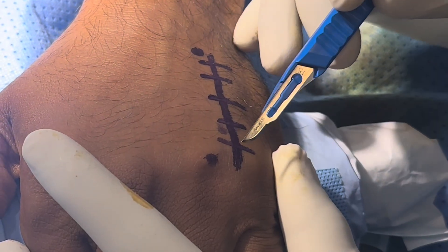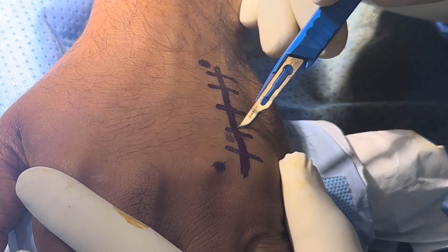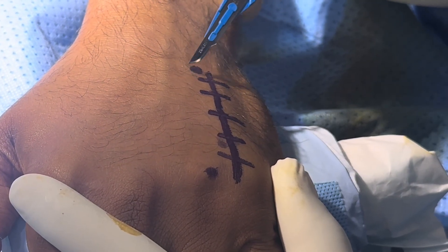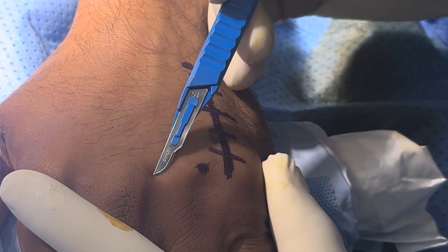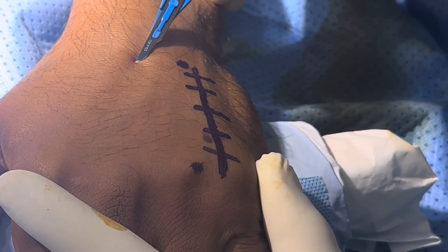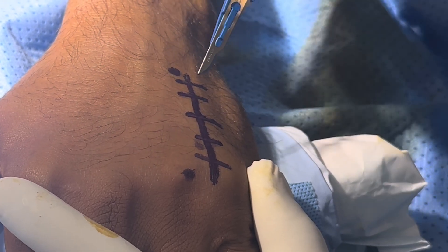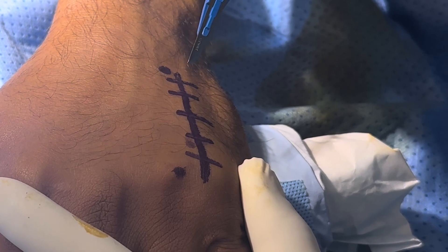This is the skin marking from the metacarpal head to the base on the ulnar aspect. This patient is having a 4th metacarpal fracture, so we are going through the ulnar aspect. If it were the 3rd metacarpal, we would go to the ulnar side of the 3rd one. If it were the 2nd, we would go to the ulnar side of the 2nd one. Now I am going to give the incision, and after the fracture exposure I will come back to you.